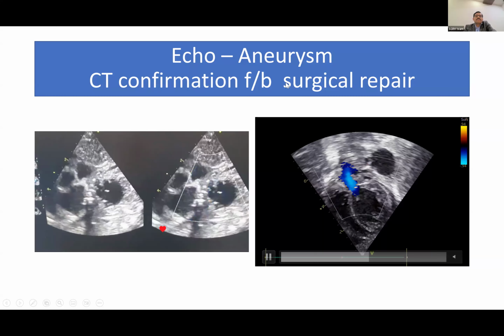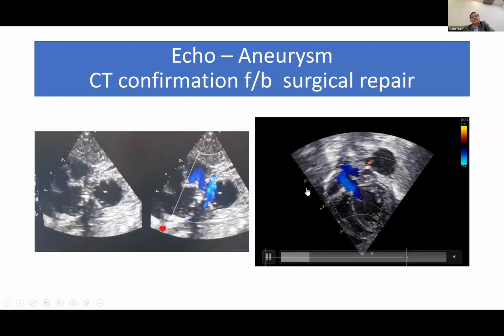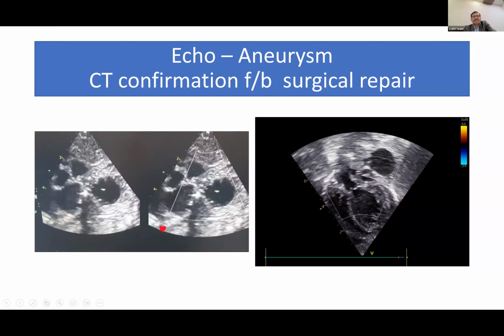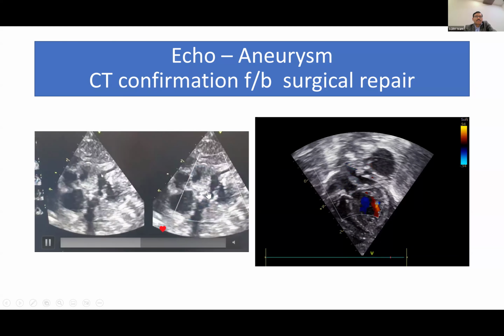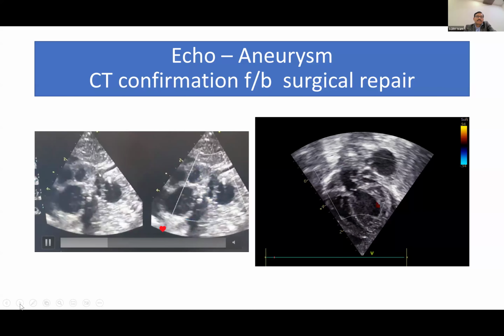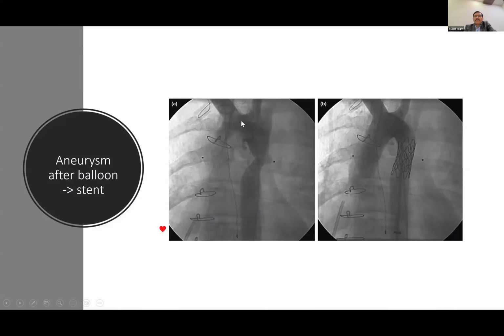Our surgical team is aggressive in managing the patient. So when the patient needed repair, we try to avoid stents in all newborns. Actually, we rarely put a stent in arch newborns. I don't remember putting a stent in a newborn child. Otherwise, if surgical backup is not there, you will need a covered stent here. This is from the net, after balloon dilatation, and then a covered stent was put. So it looks like a bigger child actually. So a covered stent is also a possibility.